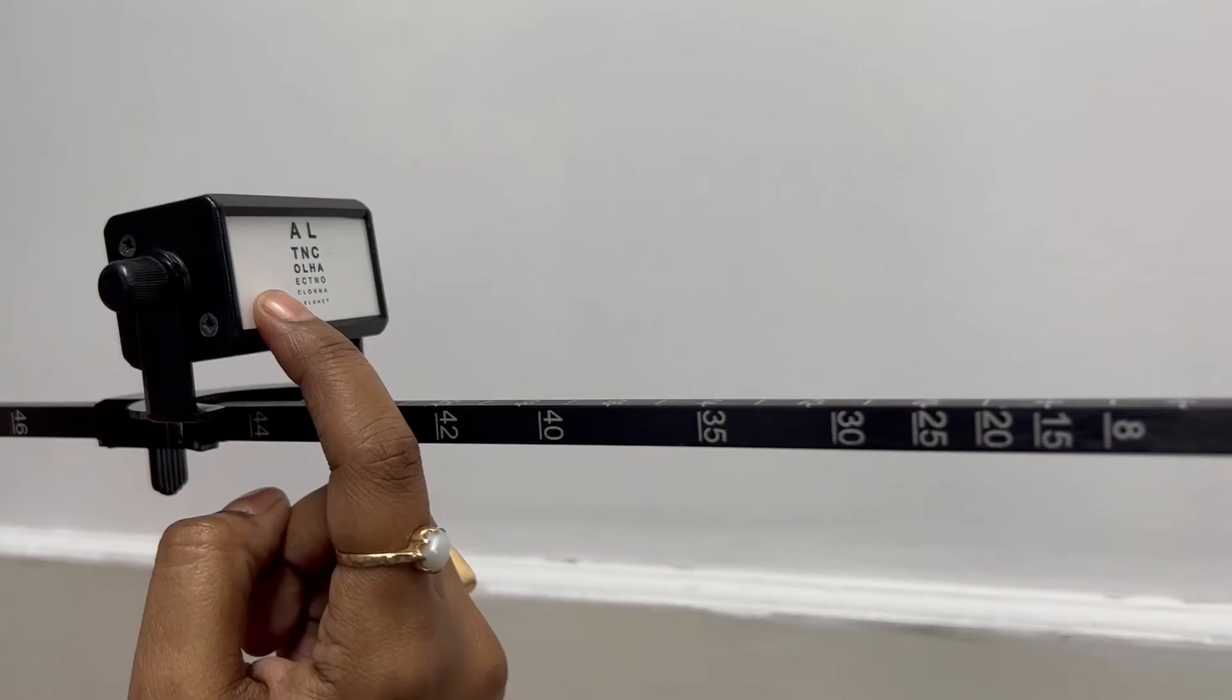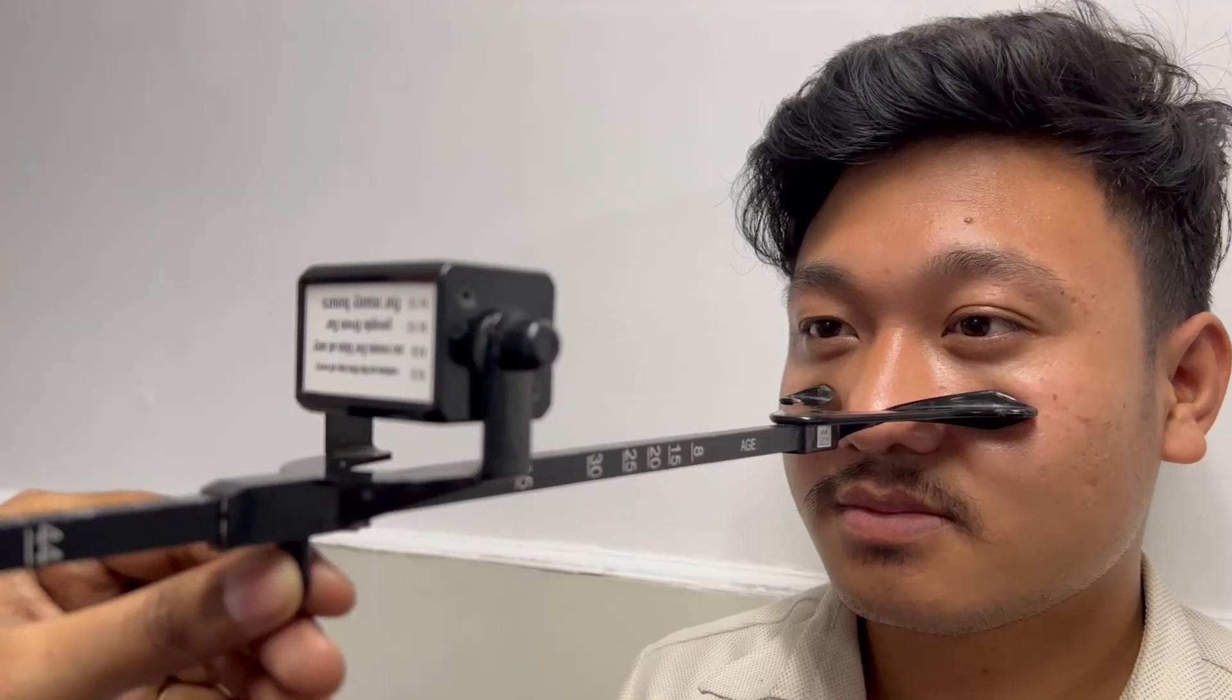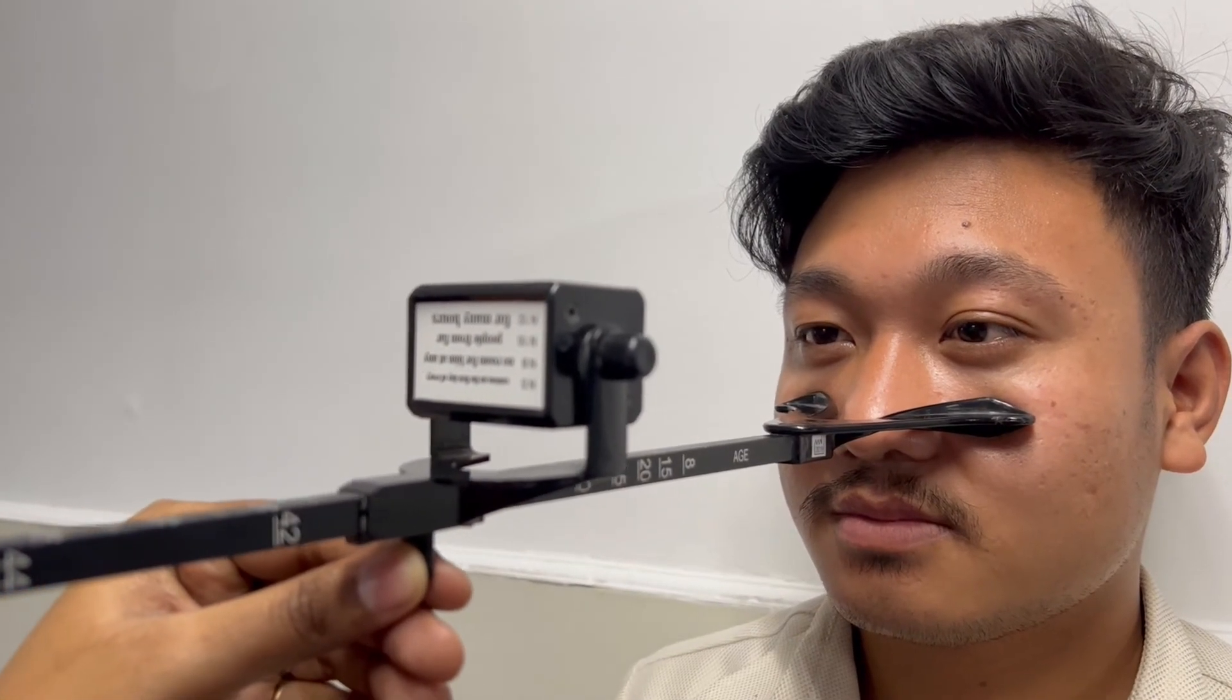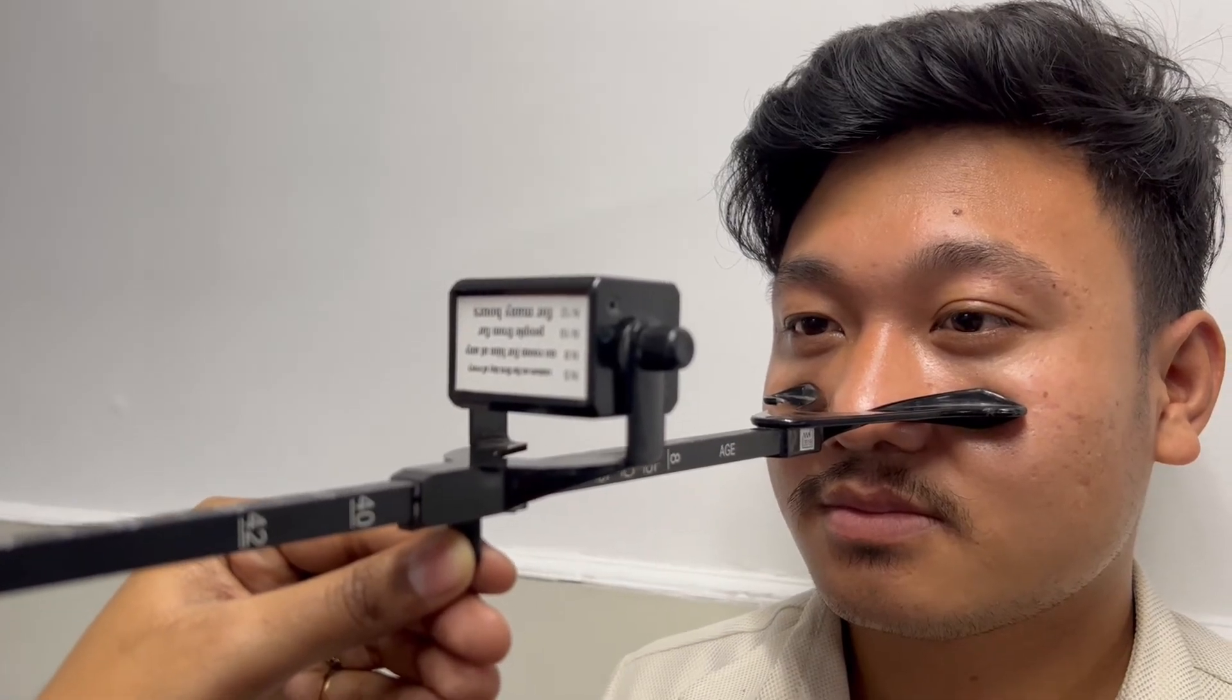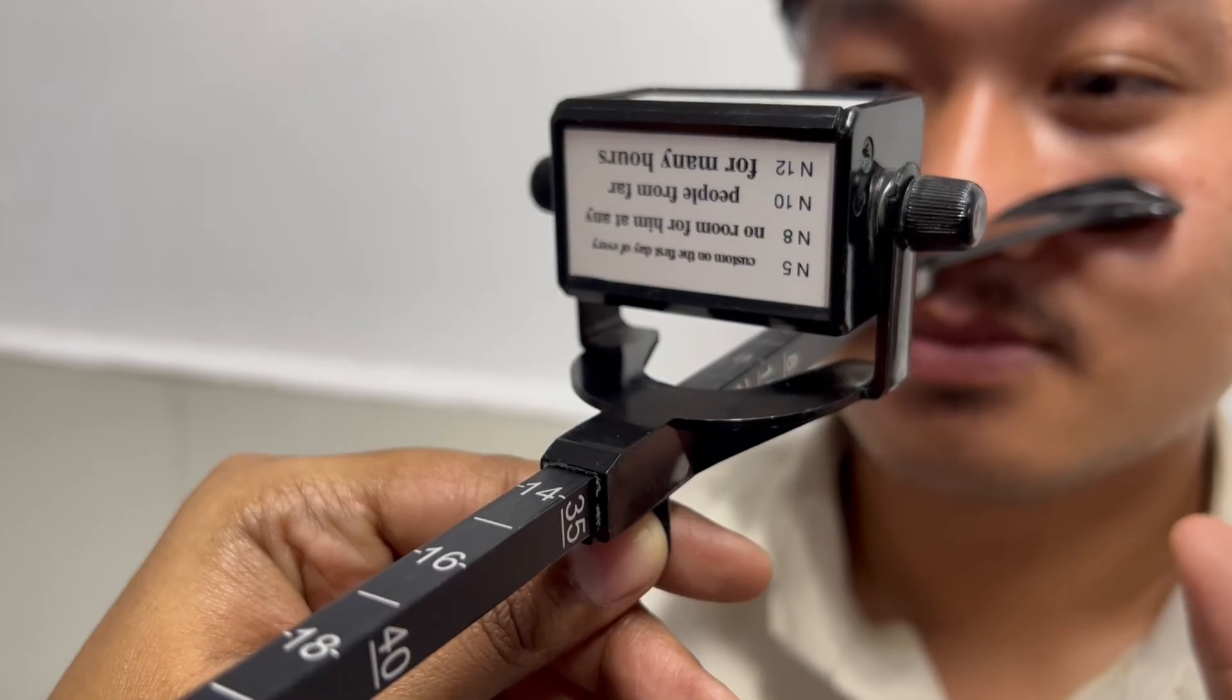Examiner asks the patient to focus on one line above the best corrected letters in the chart and slowly moves the target towards the patient's eyes at a constant linear speed. The near point of accommodation is noted when the patient reports the first sustained blur.